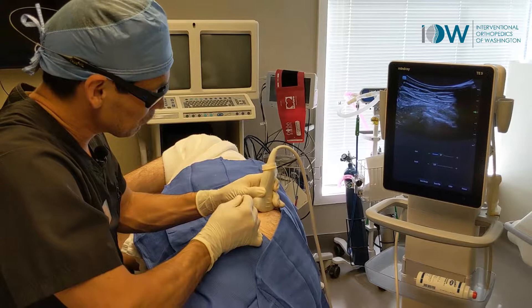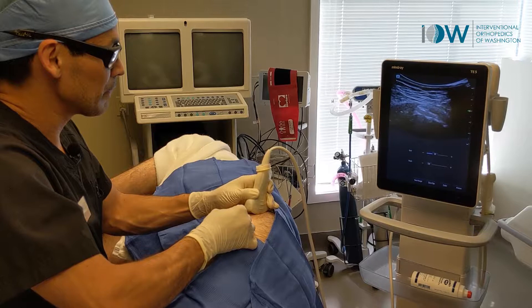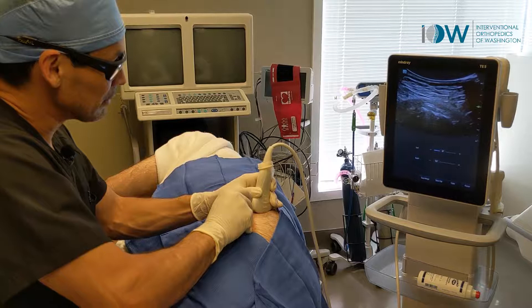We're going right into the attachment point and working at the very tip of that calcification right there. We're going to work from the top down, just working on the calcification, slowly taking it down.